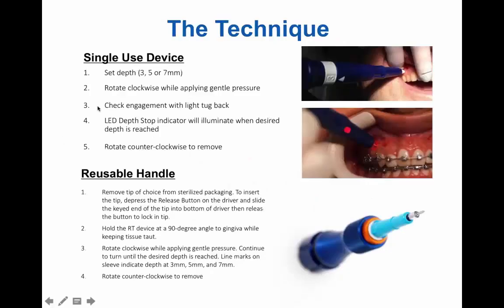All right. So with the single-use device and the reusable handle, this is the reusable handle device that I would recommend if you're going to go to the handheld route. Ever since I've used the electric handpiece, by the way, I have only used this handheld handle one time, and that was only because I forgot to recharge it. So I would highly recommend that you consider getting the electric handpiece if you're going to do this, because it is much easier for you and the patient, even though I will say this is easy as well.